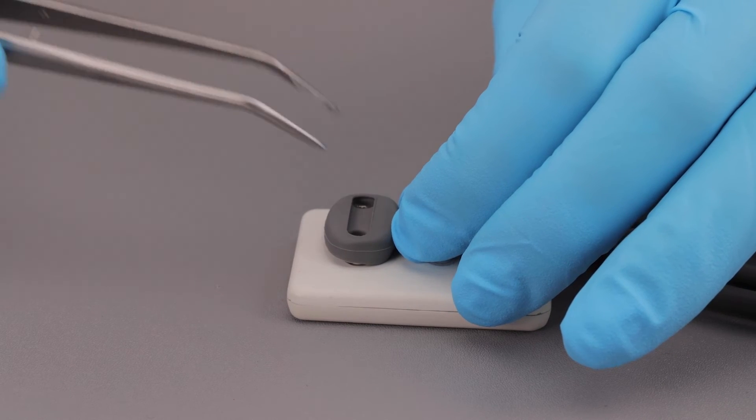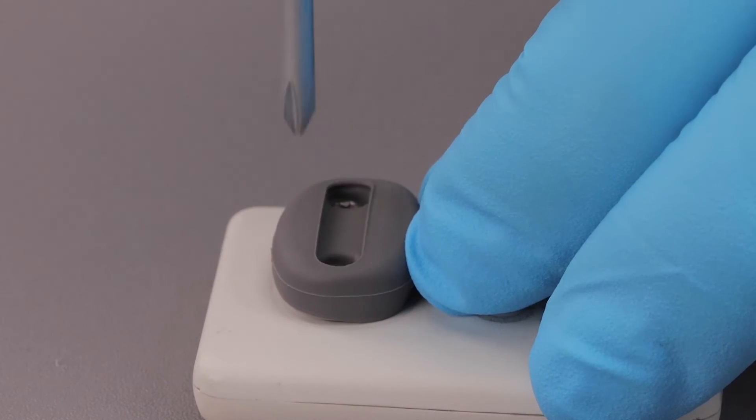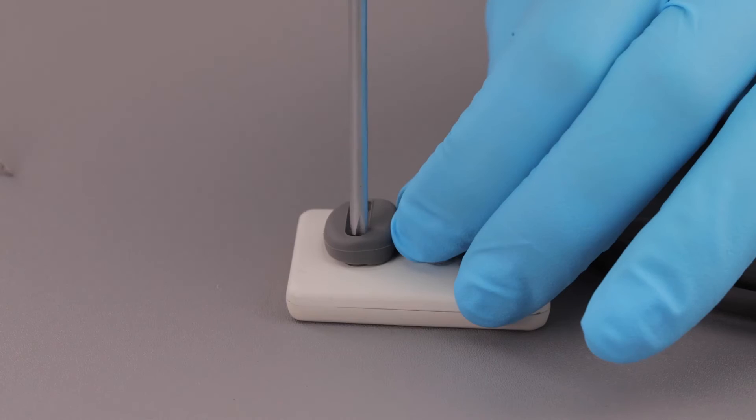Using the screwdriver, tighten the first screw just until you feel some resistance. Repeat this action for the second screw. Fully tighten both screws and make sure they are securely tightened.